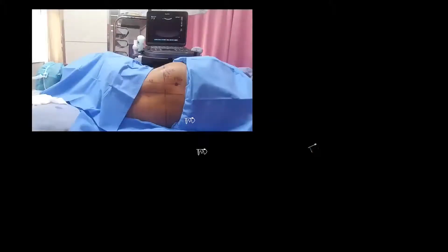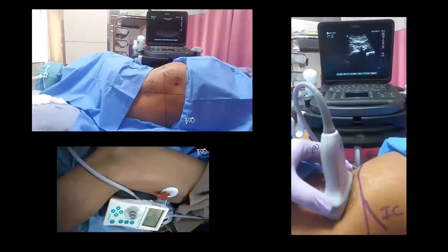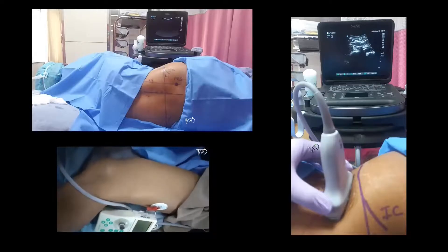The patient is placed in lateral position with a slight forward tilt and the side to be anesthetized facing up. The ultrasound machine is kept in front of the patient and the performer or the anesthesiologist usually sits or stands behind the patient. The anterior thigh up to knee of the ipsilateral side should be adequately exposed so that the twitches of the quadriceps muscle or patellar dance can be seen easily.